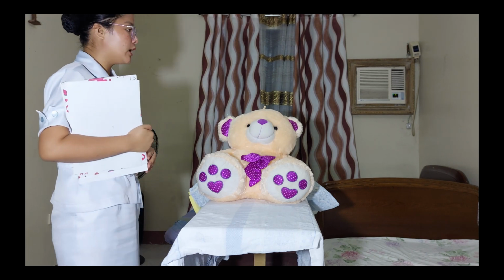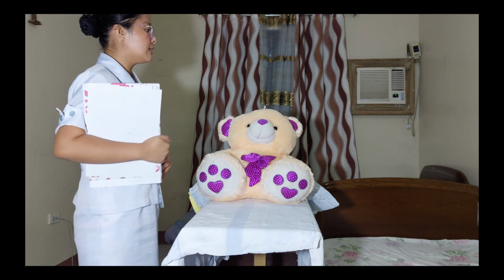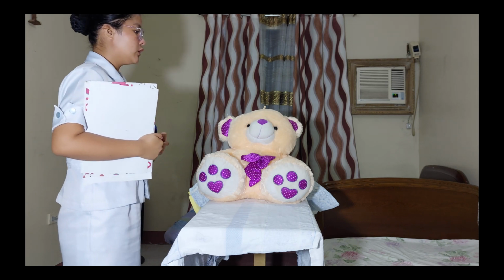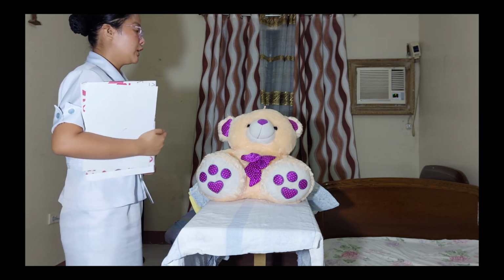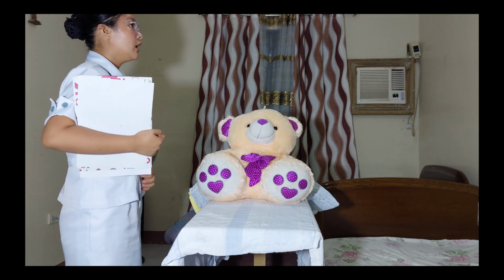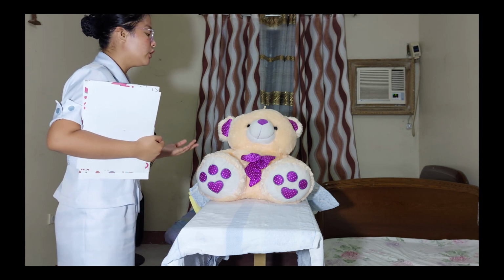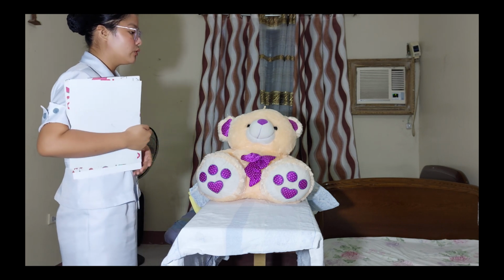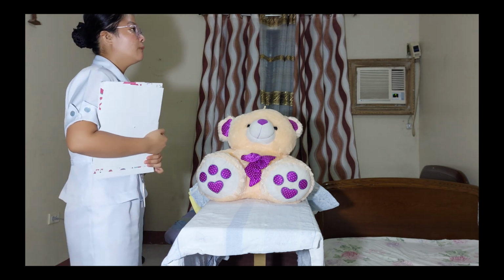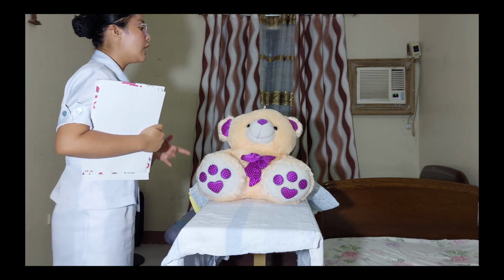Maaaring ang rason po nito ay kailangan ng sterile urine specimen para sa urine culture. Pwede din pong para ma-relieve yung bladder niyo po dahil hindi makaihi. Pwede din po siyang ginagamit bago mag-surgery ang isang patient para i-drain po yung bladder or yung urine ng isang patient. Ginagamit din po siya sa pag-measure ng output ng isang patient.